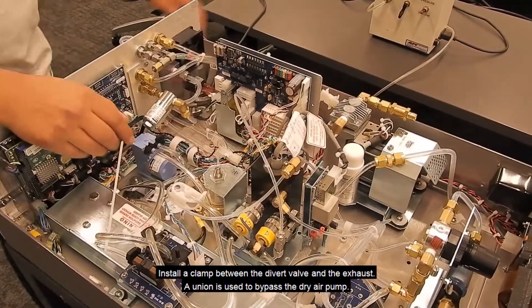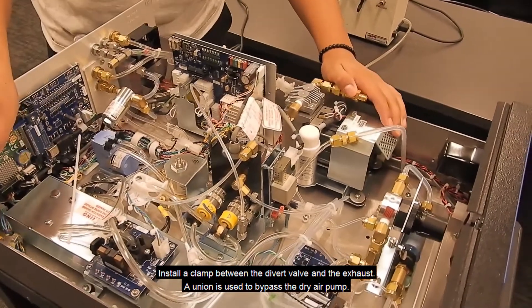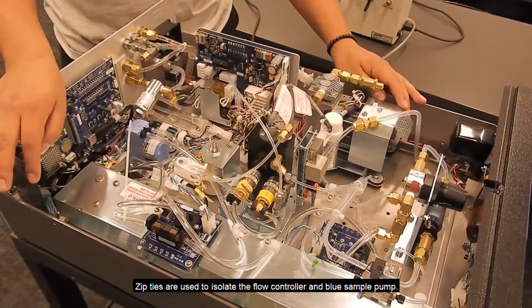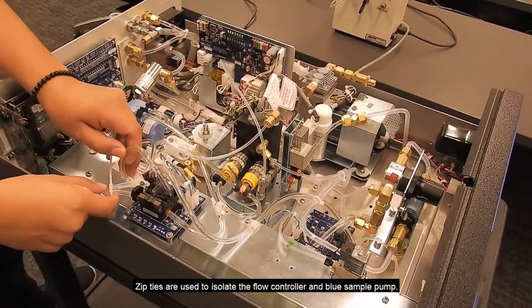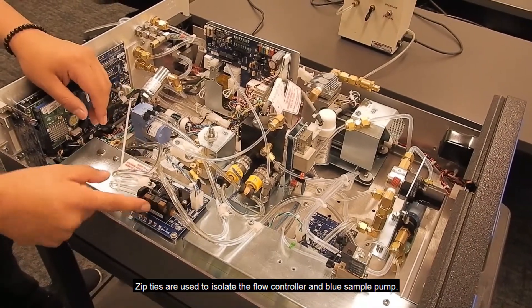Then a union is used to bypass the dry air pump. Zip ties are used to isolate the flow controller and the blue pump.